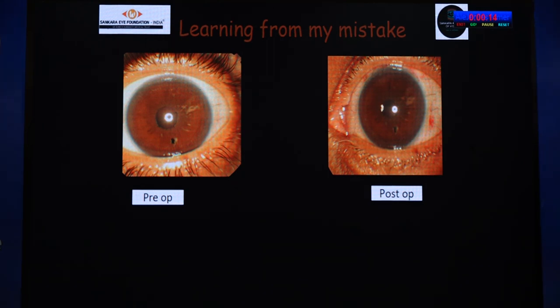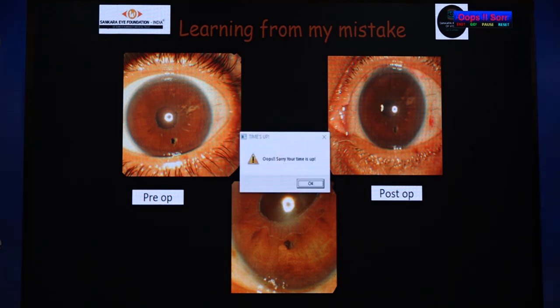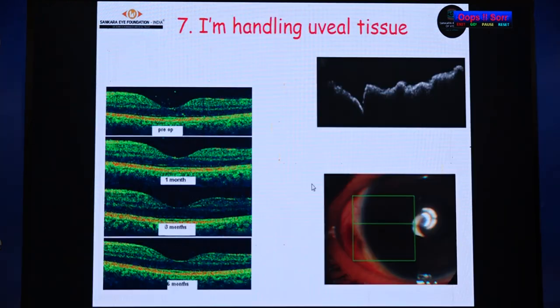Another very important issue is the site of the PI. As the name suggests — peripheral iridectomy — it should be done in the periphery. In one case I had a mid-peripheral iridectomy, and when I dilated the patient, the optic edge got captured and it resulted in pupillary block glaucoma. Theoretically, one can anticipate CME since we are handling the uveal tissue, but practically there is very low chance of developing it.